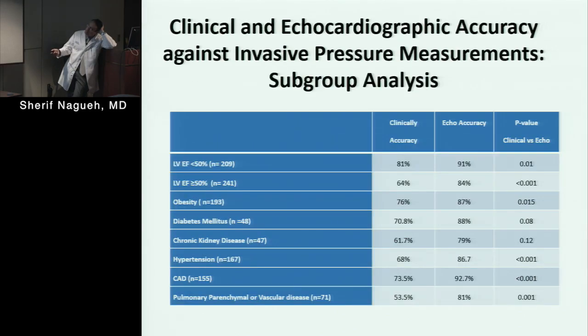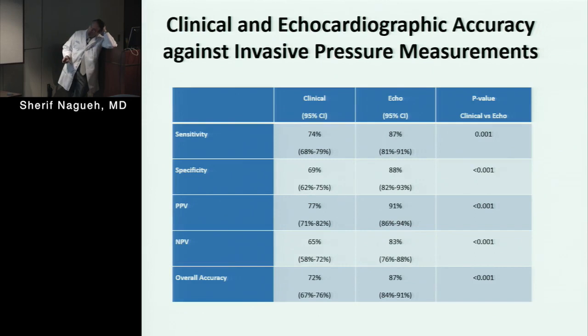And that group was taken out when you calculated these? Yes, analysis. Okay. Clinical is physical exam. Including what? When you say clinical, it's physical exam and some X-ray. So X-ray, physical, the complete chart review. What you use as a doctor, putting them together.